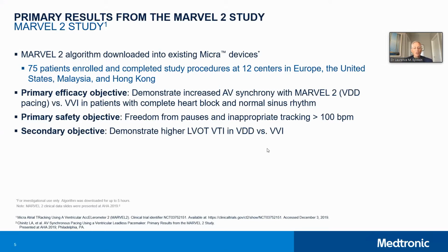And so if you uploaded it and left it, you'd run the battery too quickly. So it really did take the redesign of the Micra AV to have this be long-term. That being said, uploading it for a 4 to 6 hour period while we did the study didn't have an excessive battery strain, and that's how the study was done.